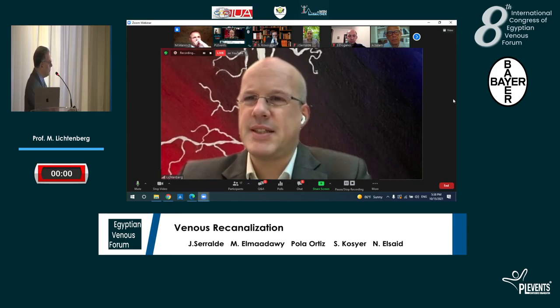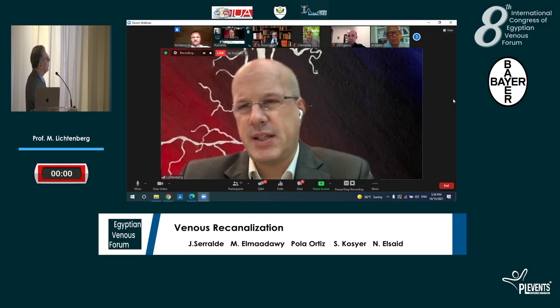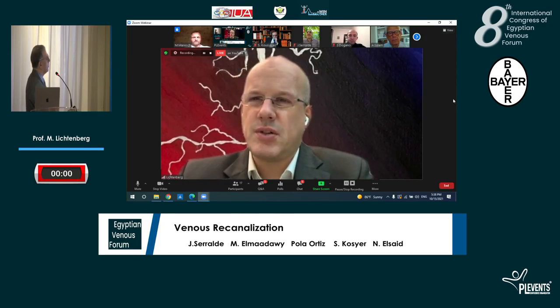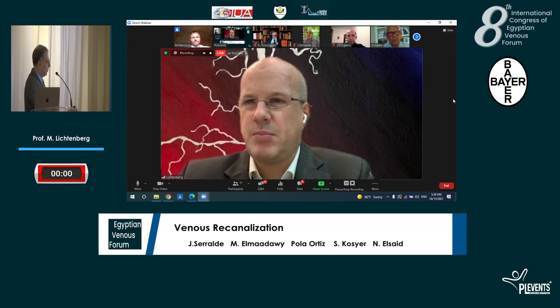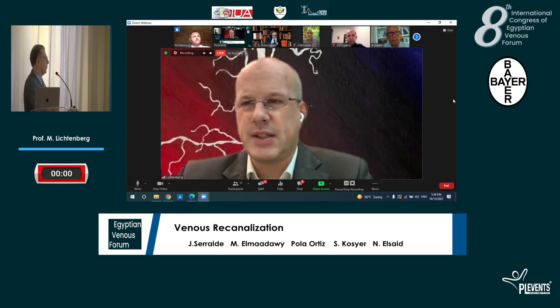Yeah, unfortunately this is difficult. So therefore I advocate to really perform a very good sizing for these stents. If you don't have intravascular ultrasound, then I would recommend to do a lot of angulation to define the correct reference vessel diameter. If this is not possible on the site you treat because everything is destroyed, then I would recommend to do an angio of the contralateral side to learn a little bit more about reference vessel diameter.